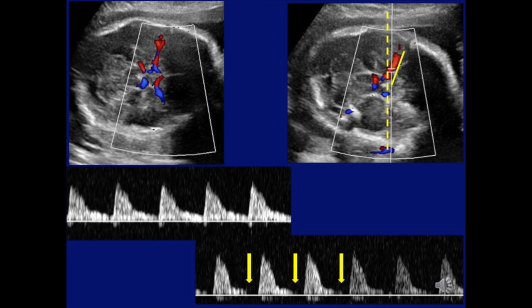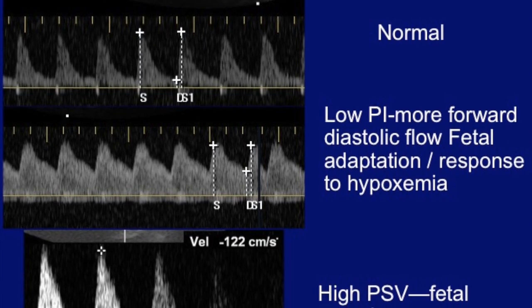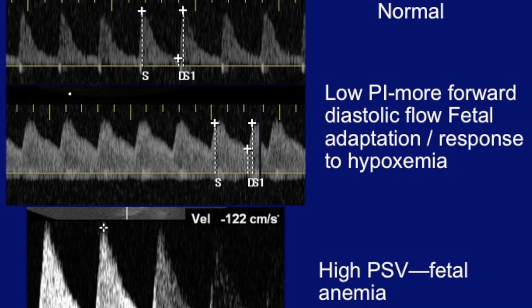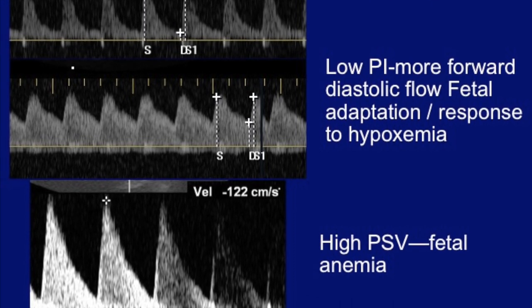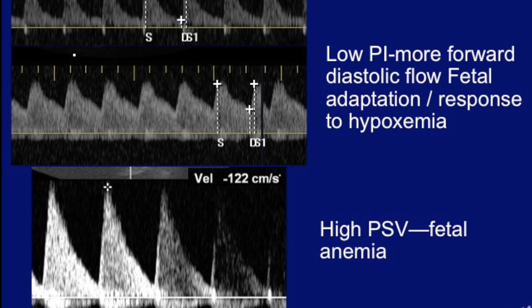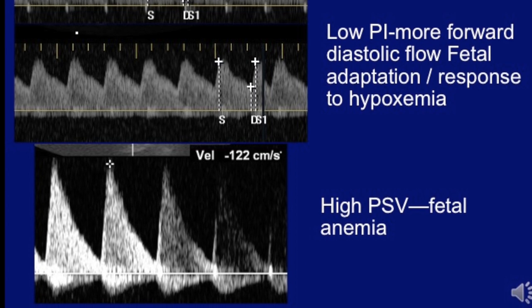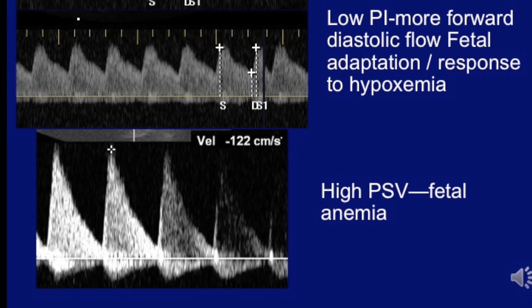If you apply unnecessary pressure on the fetal head, you start seeing a pulsatile pattern and lose the forward diastolic flow, so avoid this. In brain-sparing, vasodilatation leads to a low PI below the 5th percentile and increased forward diastolic flow — the MCA spectrum begins to look like the umbilical artery, a phenomenon called umbilicalization of the MCA. For anemia, PSV is measured in MoMs and a value greater than 1.5 MoMs is abnormal; as shown here, a PSV of about 122 at 25–26 weeks was a case of fetal anemia.